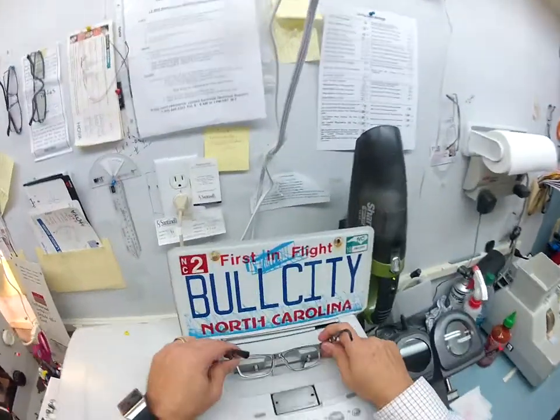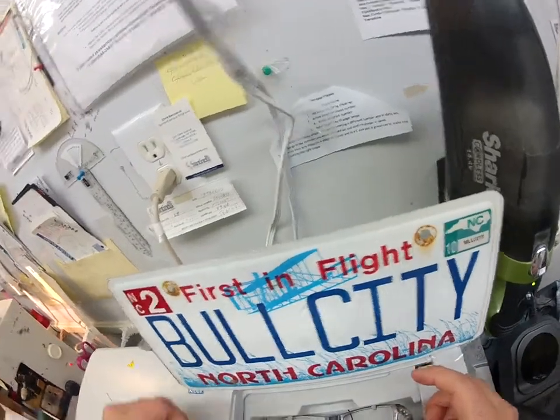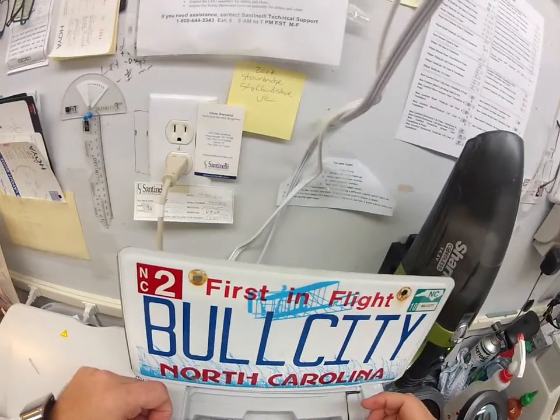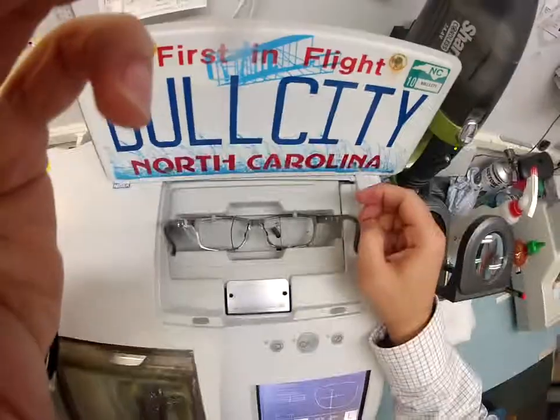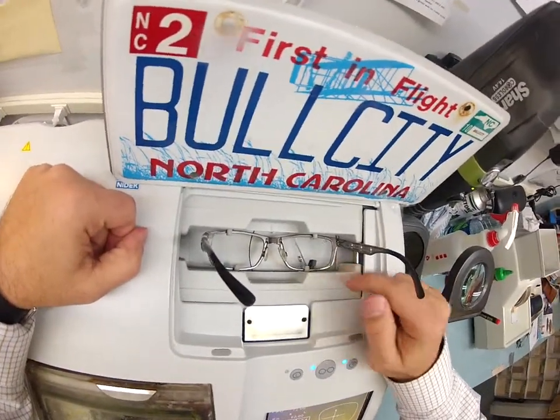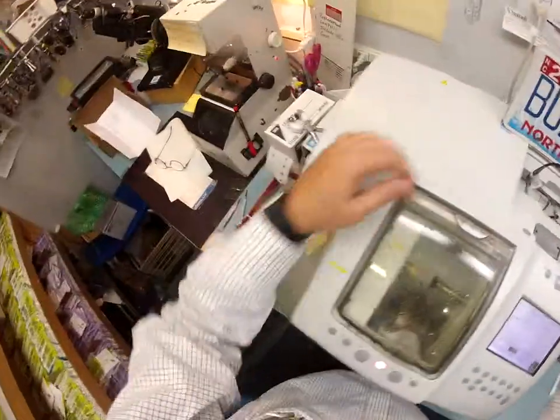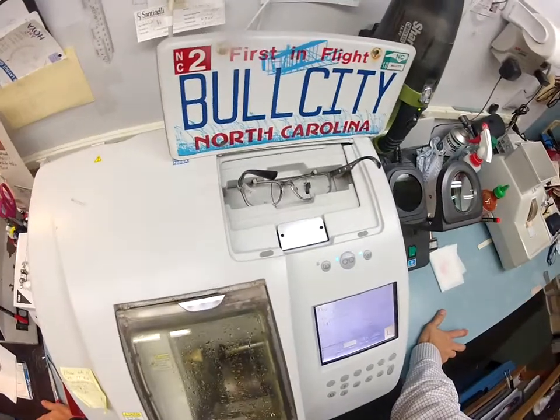First things first, I'm going to trace this frame. It is tracing the inside bevel of your frame — tracing the left lens first, then it's going to go across and change. If any of this is out of focus, I humbly apologize. I am a professional optician, I am not a professional cinematographer.